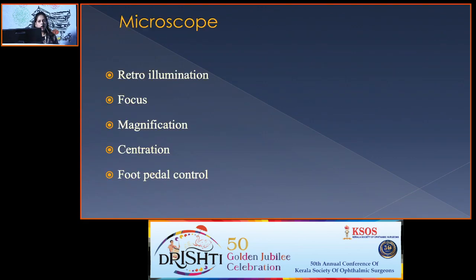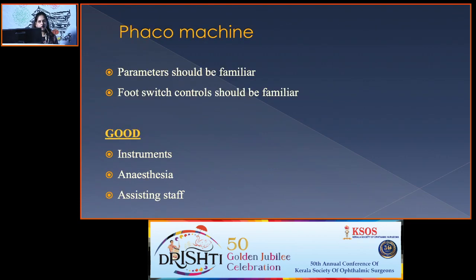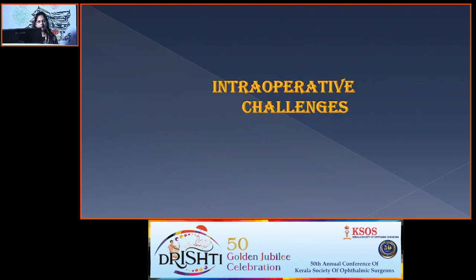You should have a good knowledge of your machines. The microscope should have good retroillumination, proper focusing, magnification, centration, and you should be aware of the foot pedal control. Phaco parameters and the foot switch controls should be familiar. Apart from this, we also need good instruments, anesthesia, and supporting staff.